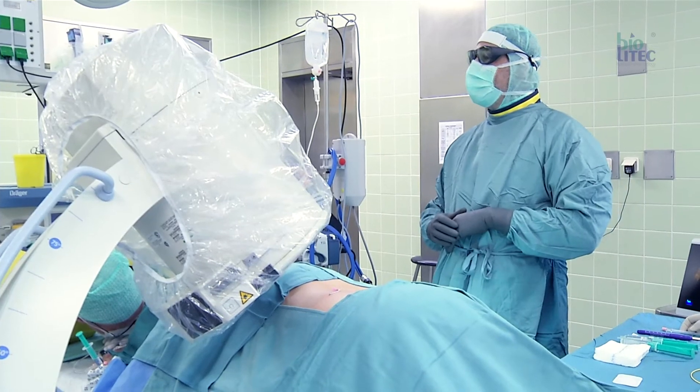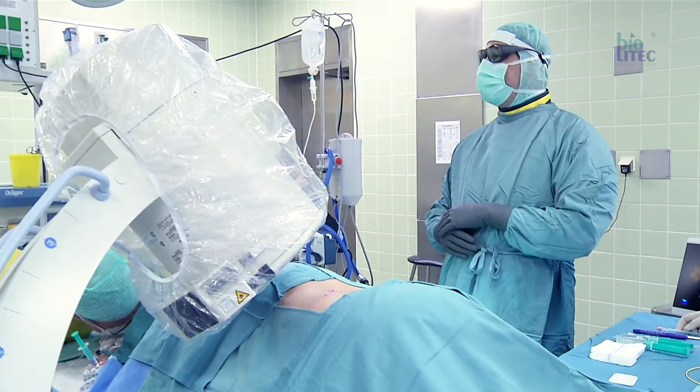Percutaneous laser discus decompression, in short PLDD, is an effective hyperthermal minimal invasive treatment for contained disc herniations.